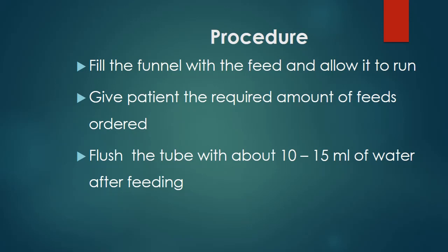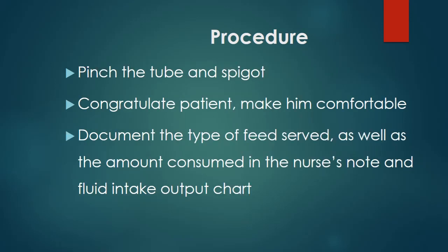So do not be surprised, just a few minutes or few hours ago, you gave a patient, let's say, milk feeding. Then some hours later, you go to feed, and that tube is not patent any longer, because possibly the milk has solidified and blocked the tube. So it's always advisable that we flush with about 10 to 15 ml of water after feeding the patient.